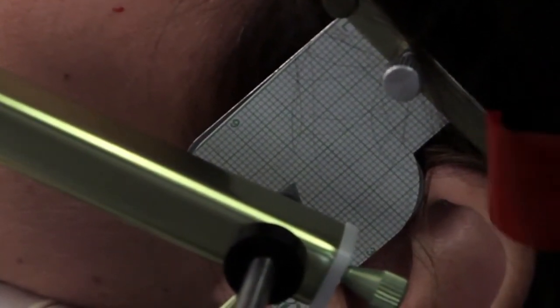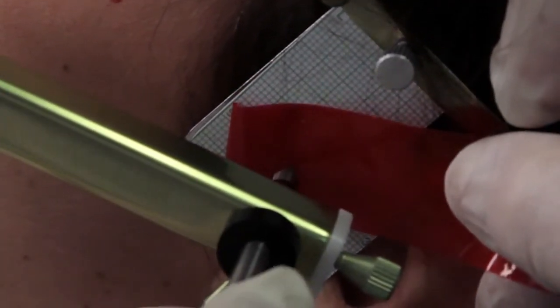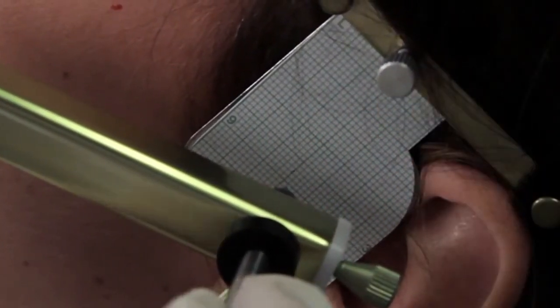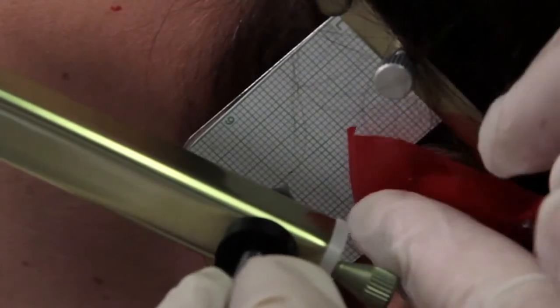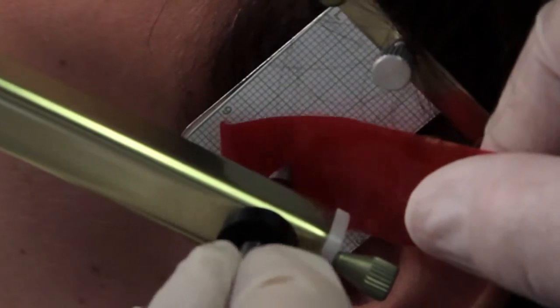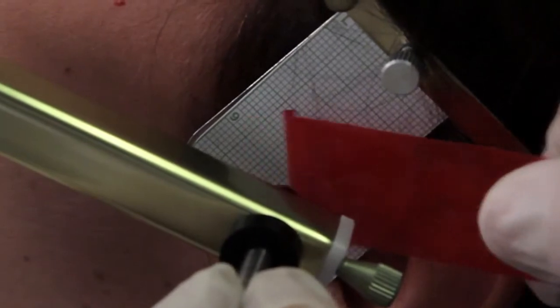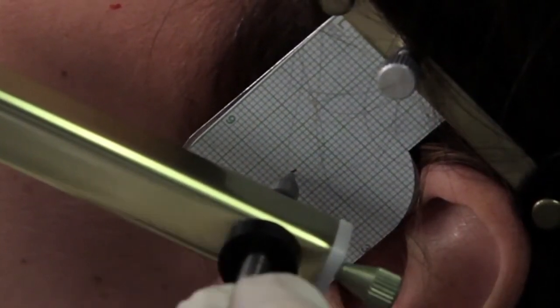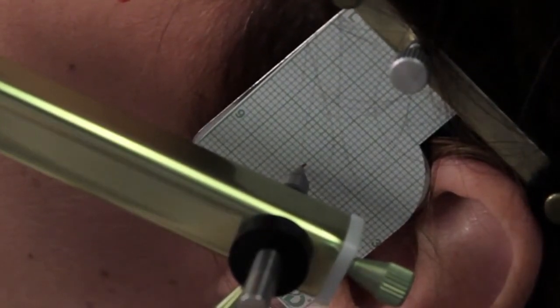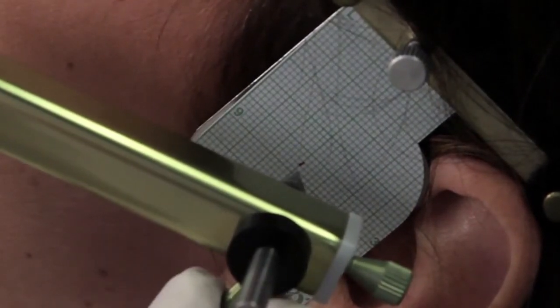Now we're going to mark the axis on the flag. We're going to use red articulating paper, move in, and push the pen in, pull a little bit on the paper, and let's see. Open, now pull it out. Let's do it again. We got a red dot, but I want a little bigger red dot. Move the paper a little. Okay. There, you can see the red dot now. There, see where the pen is? There's a mark above it, but right at that dot. Okay, so we've located the axis on the flag.